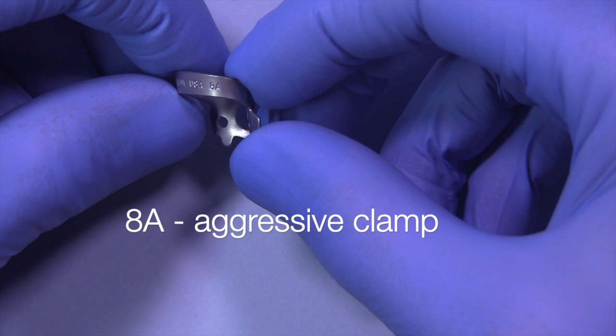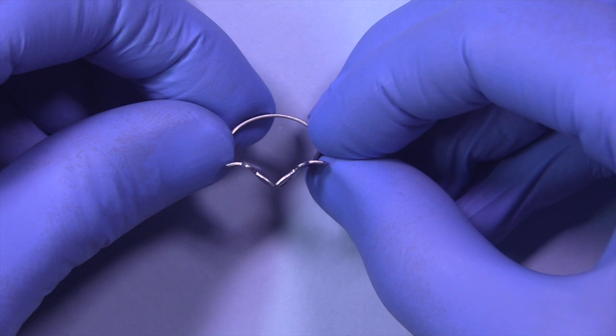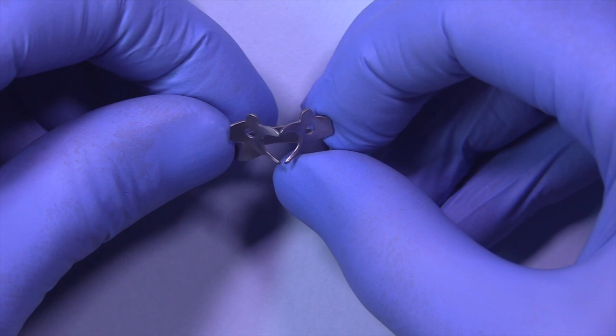This is a clamp that I don't use very often — it's an 8A. I don't like it because it's very aggressive, and the patient will need to be anesthetized on both the facial and lingual side. If you're doing a maxillary isolation, this requires a lingual injection. So these are rarely used.